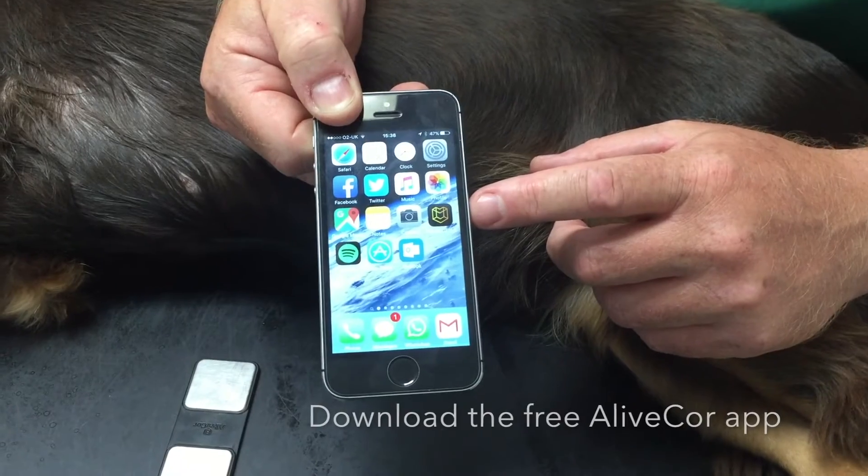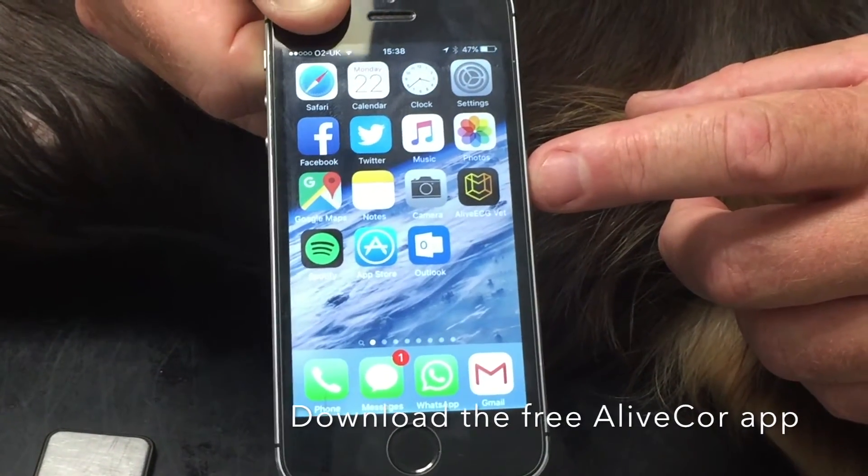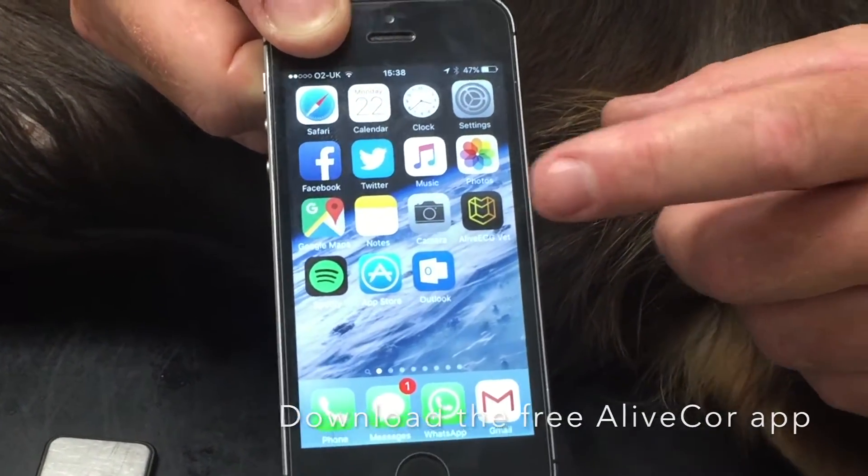You need to download the AliveCore veterinary app. And to record an ECG, open the app.